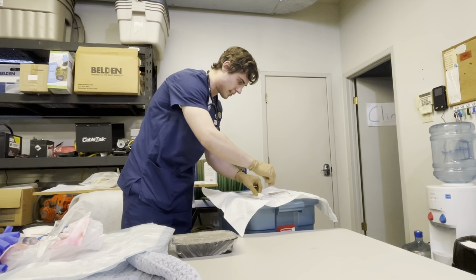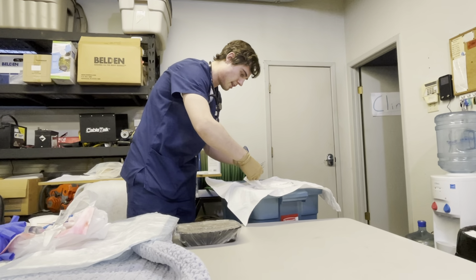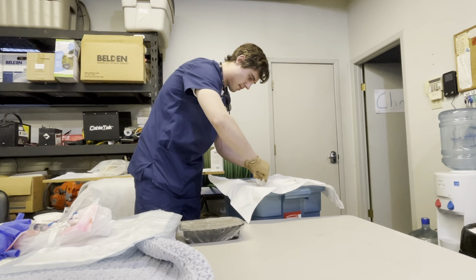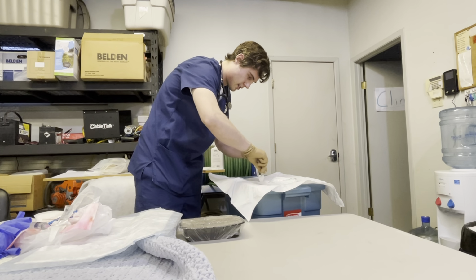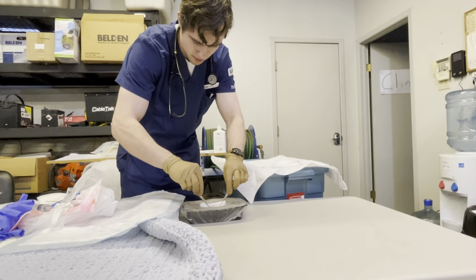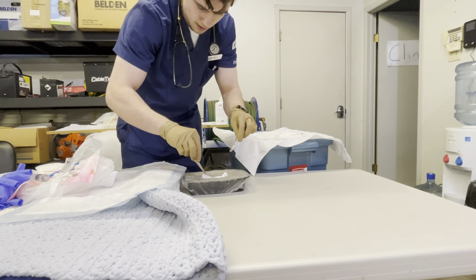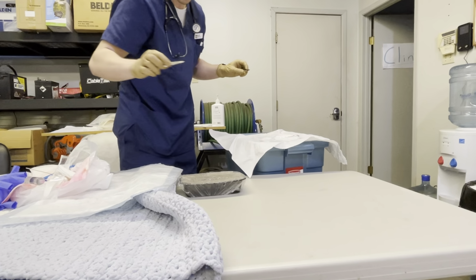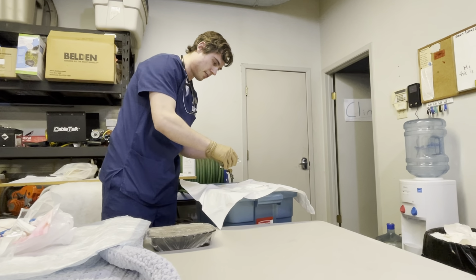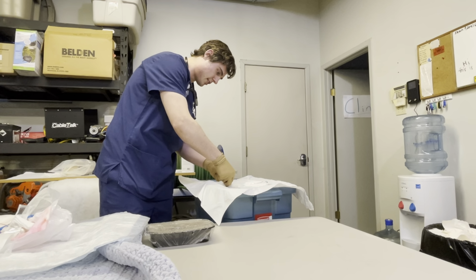So next I'm going to use my forceps, and I'm going to make this there, and I'm going to put that in the middle of the wound there to soak up the excess and let it sit. Okay. And I noticed that that has soaked up all the excess there, so now I'm going to clean the peri-wound skin.